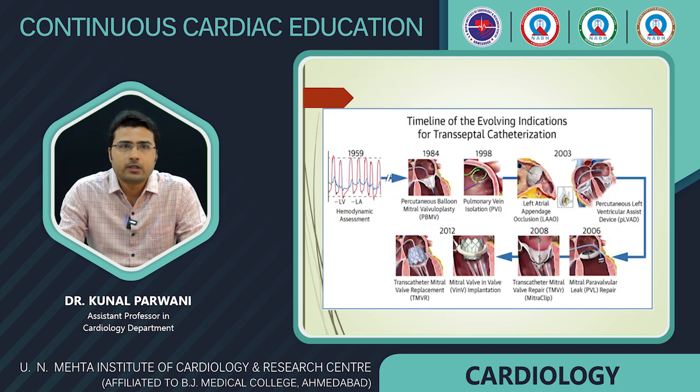This slide shows the evolution of the indications for transseptal catheterization. As you can see, first of all, it was used for hemodynamic assessment, and then for the PTMC, and then it was used for the pulmonary vein isolation procedures, and then eventually it was used for the MitraClip, and then for the TMVR as time evolved.